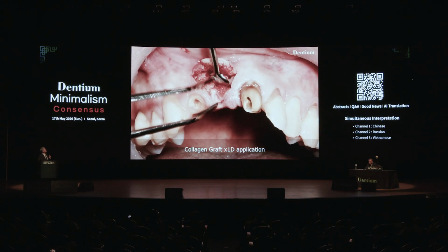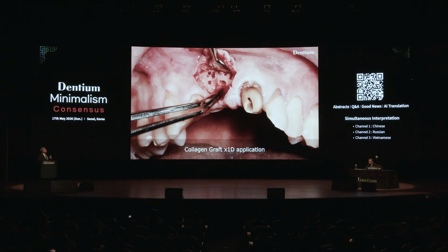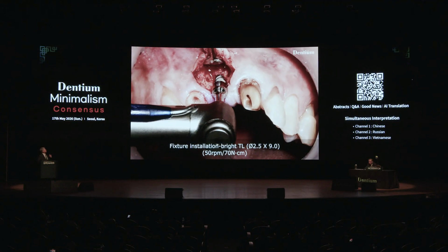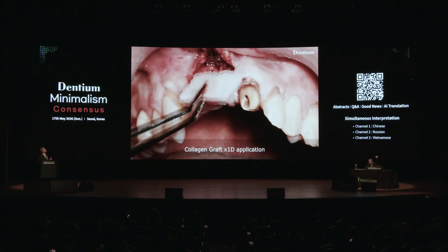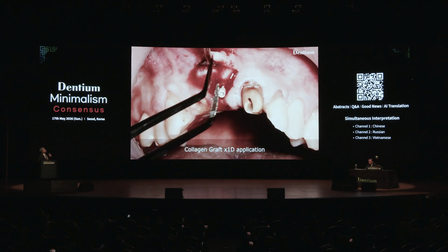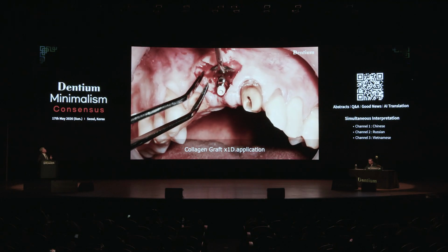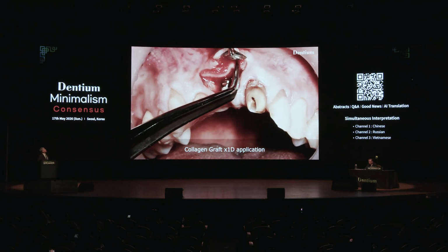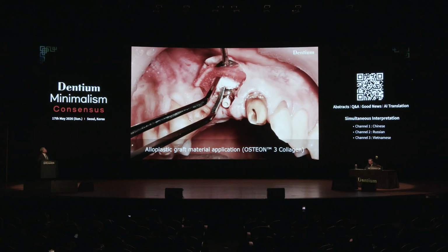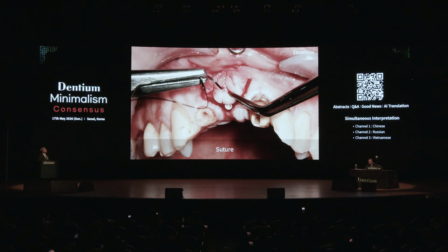the palatal bone is also still very thin, so we place a collagen graft. The collagen graft is not only for thickening the soft tissue but also for some bone formation, because it has two layers: one is a thick layer, and the lower one is a very loose area. Before the resorption of the thick layer, tissue forms in the lower loose area, and finally there can be bone. That's the reason we place the collagen graft on the palatal side. On the labial side, we use a xenograft to finish the surgery very simply. After the suture, it was finished.